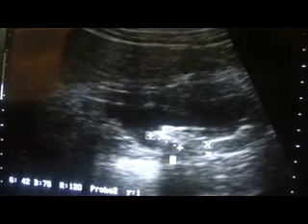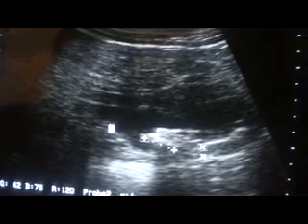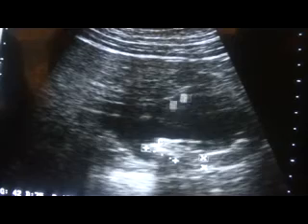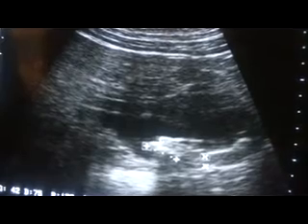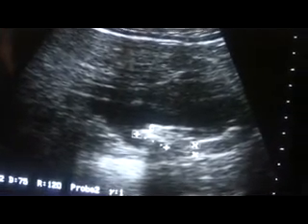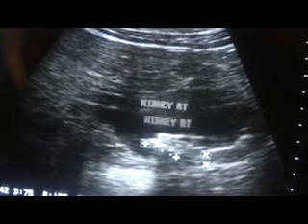So this is a case of obstructive uropathy due to a calculus in the pelviureteric junction, long-standing, compromising the parenchymal thickness a bit, with parenchymal changes and relatively muffled, or we can say loss of, corticomedullary differentiation in the right kidney. This is the outer surface of the kidney, and below the capsule are the cortex and medulla.